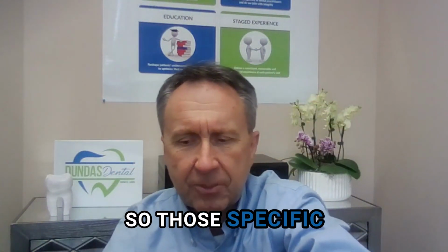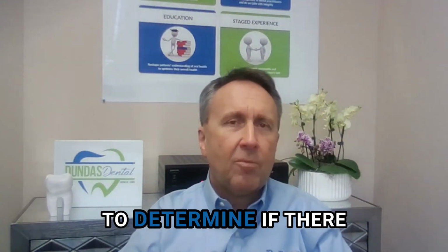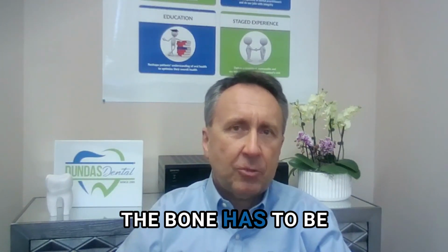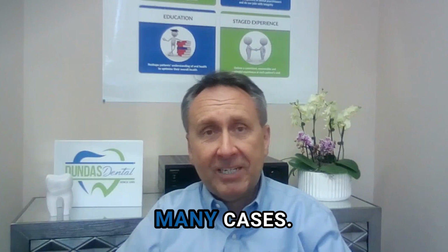So those specific x-rays allow us to determine if there is enough bone. If there's not enough bone, the bone has to be reconstructed. It is possible in many cases. It's just an extra procedure.